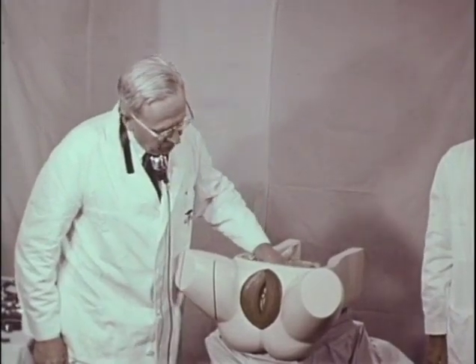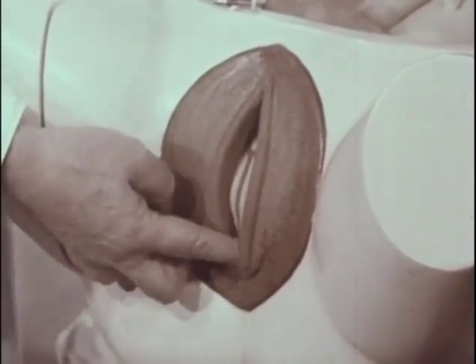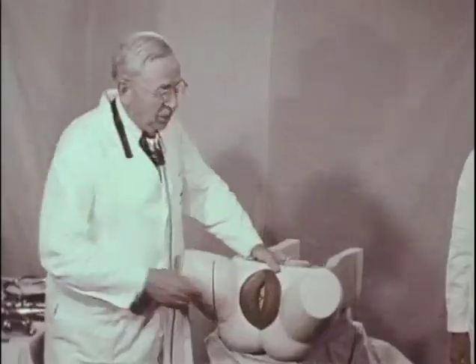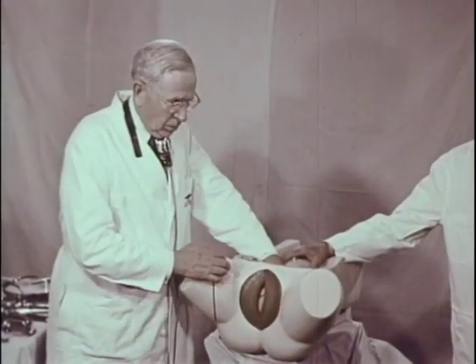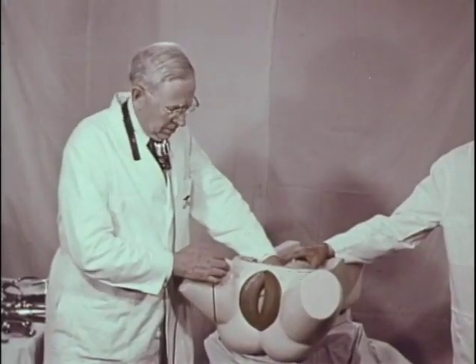OP. The posterior fontanelle is between 5 and 7 o'clock. It may be at 6. The question arises as to whether to rotate this occiput to anterior before traction or not. In the majority of instances, the rotation is carried out to anterior, either instrumentally or manually. In a small percentage of cases, it's undesirable to rotate to anterior, and the head should be delivered as an occiput posterior.